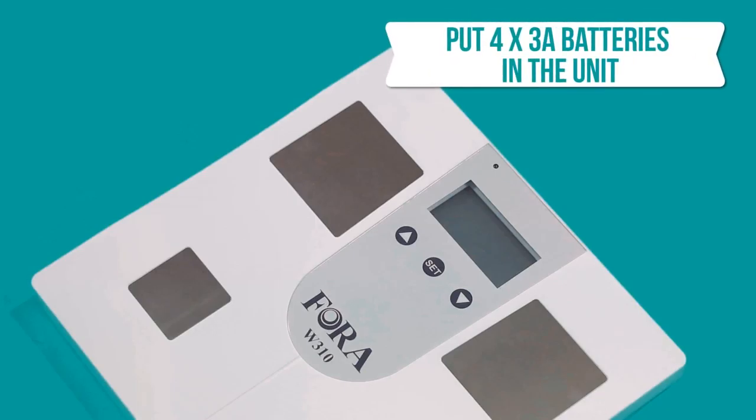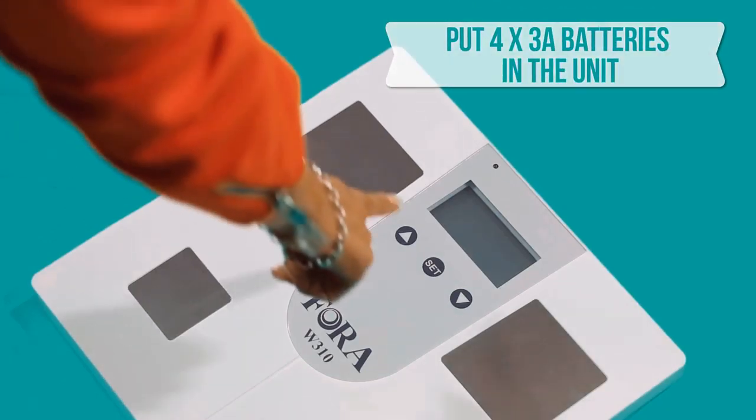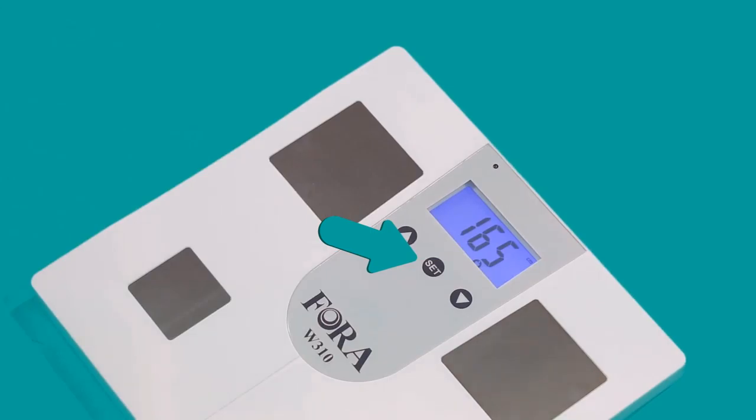Firstly, put four 3A batteries in the unit. Tap on the Set button to turn on the device.